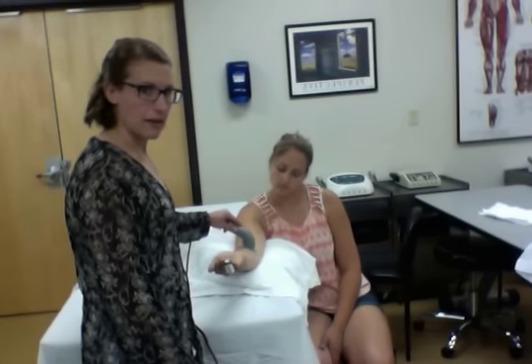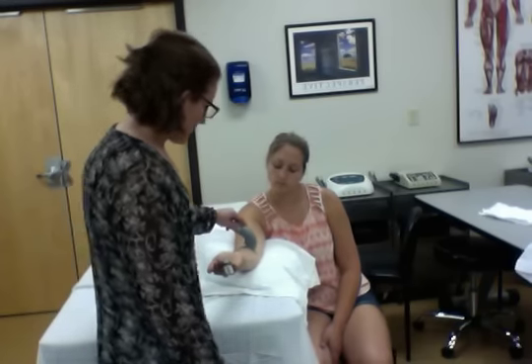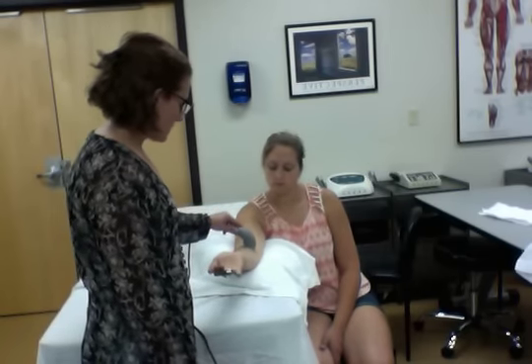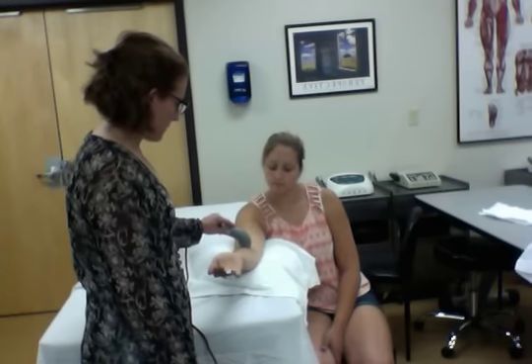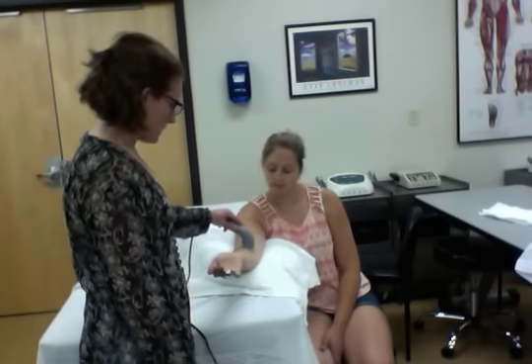I'm just staying right in the area where that tension is felt. Some gel back up. And I'm standing in a comfortable position that I can do for 10 or 12 minutes. Is that feeling okay? Mm-hmm. A little bit? If it gets too hot, just let me know. Okay.